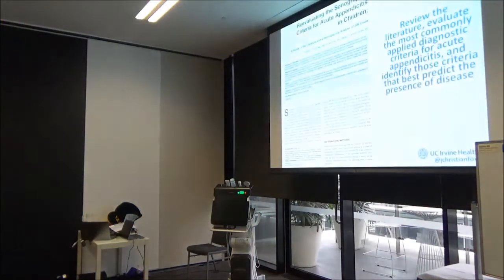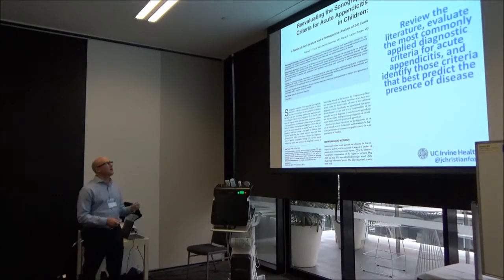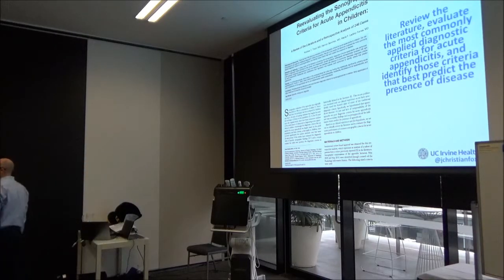Okay. Now, I looked around the literature and tried to find what the real criteria are to prognosticate some of these appendiceal structures. What are the radiologists talking about? What are the real experts, the pediatric sonographers, talking about here? Because in some pediatric centers, you get these pediatric sonographers and they are absolutely obsessed with the art of appendiceal ultrasound. And then they write about it, and that's how I learned so much about it.